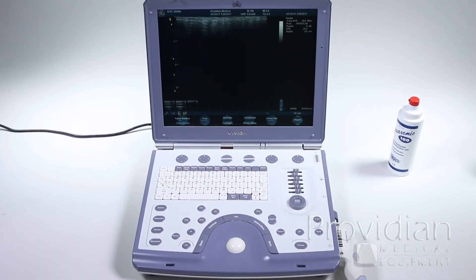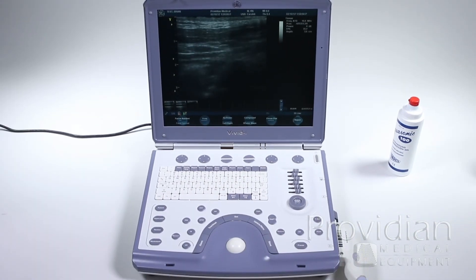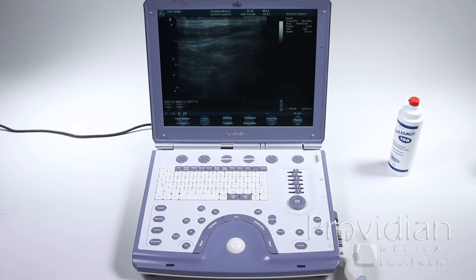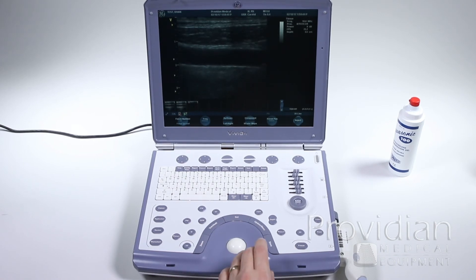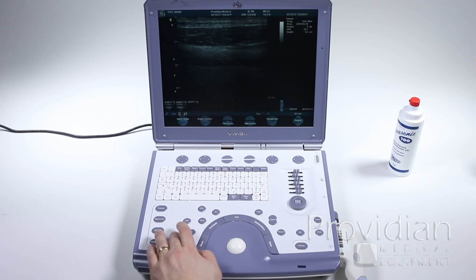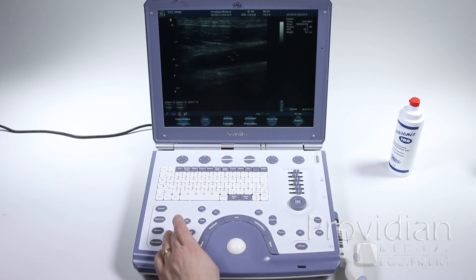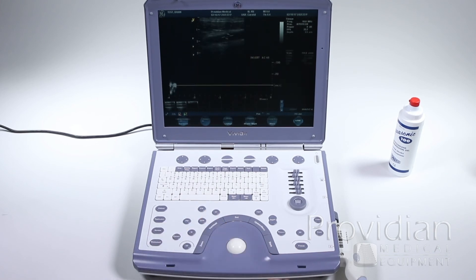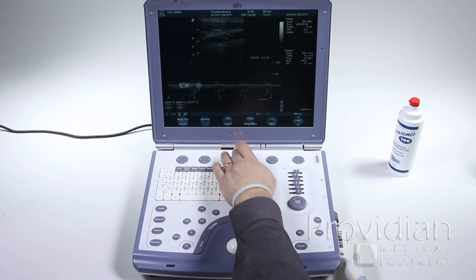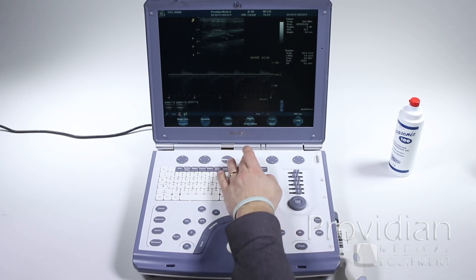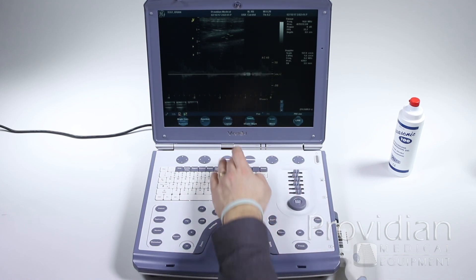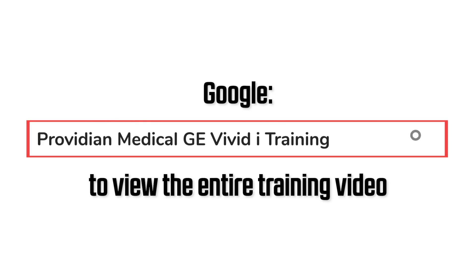Moving on quickly to Doppler measurements. I'll get my cursor and hit PW to get pulsed wave Doppler up. I'm going to invert that, then select ASO for auto.